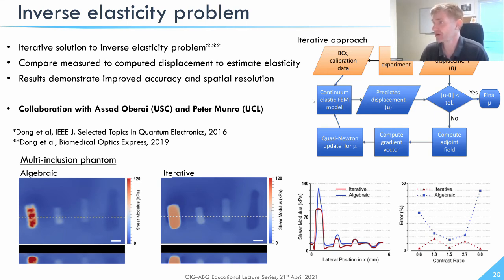Right. Then your second question, could you use other optical imaging techniques? Absolutely. If we look at the original slide, you just need to measure deformation somehow. We've even developed simple techniques, and we've just published a paper using a smartphone where we track deformation using a digital camera.